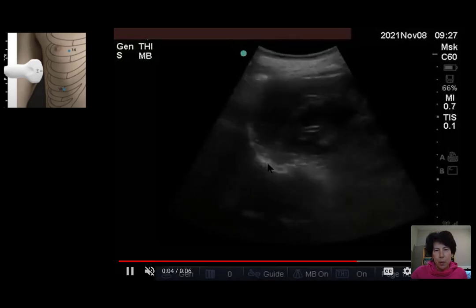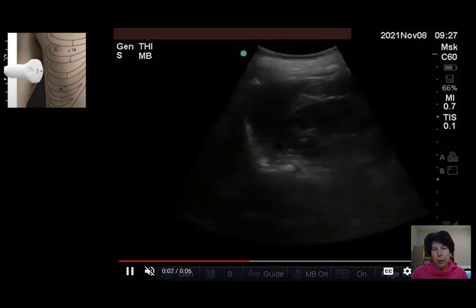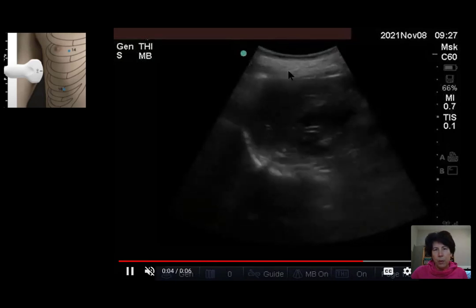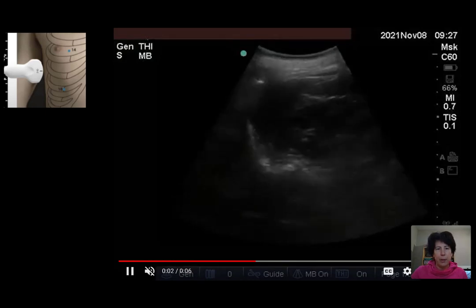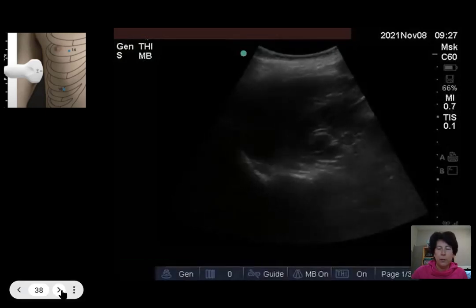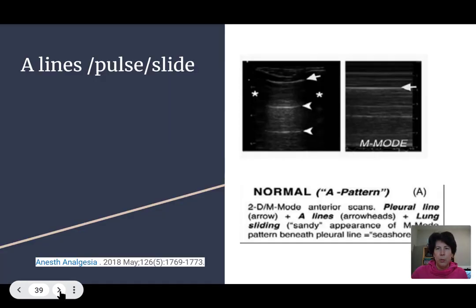The spine does not go beyond the diaphragm, so there's no fluid here. And we see the curtain come up. We see no fluid below the diaphragm. We see no fluid above the diaphragm. Normal subcostal. So what does a normal lung look like? We would see A-lines, we would see pulse, and we would see slide.